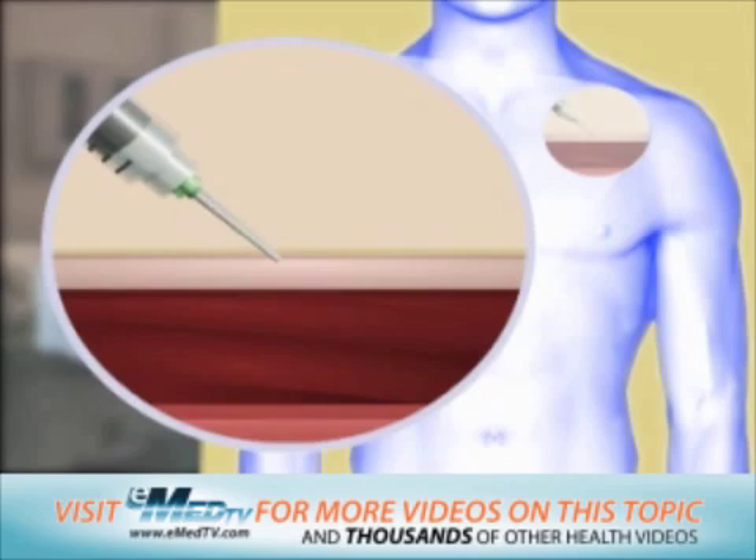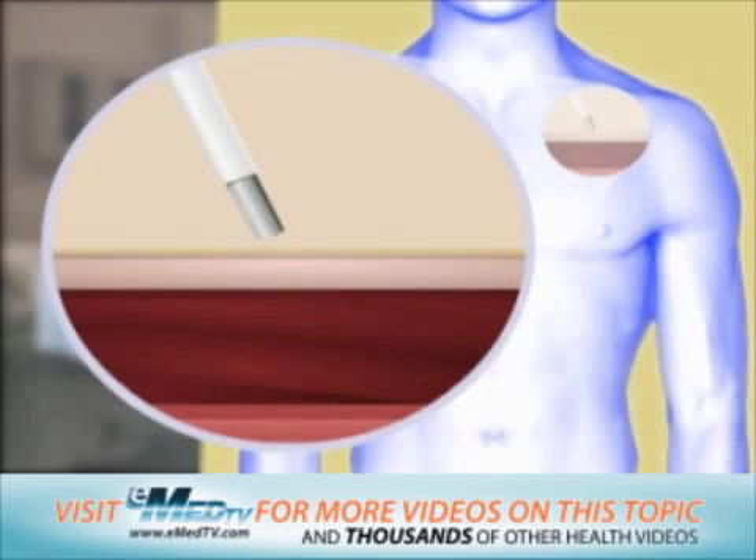One or more shots of numbing medicine is given in the chest or stomach area using a small needle. In order to attach the wire leads to the heart, the doctor needs a pathway through one of the veins.